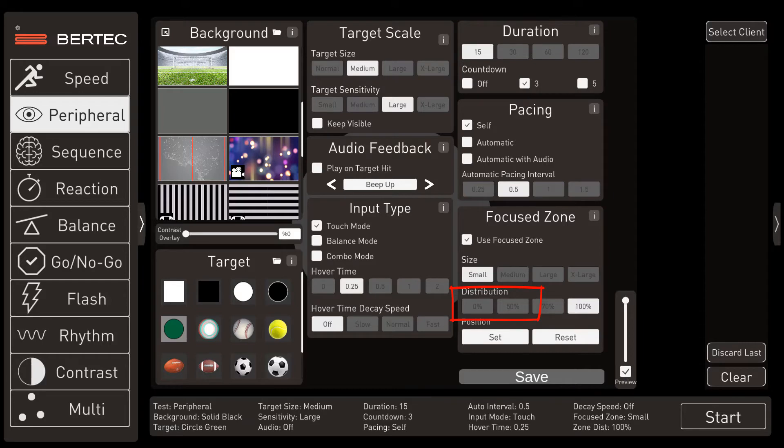Next we'll set the target distribution to 50%, placing half the targets in the central vision and the other half in the peripheral vision. This gives us the second baseline, which shows us what happens when the central and peripheral vision systems are interacting.